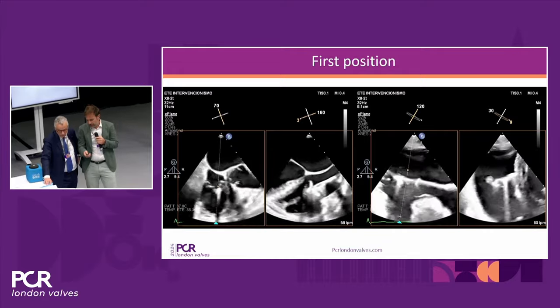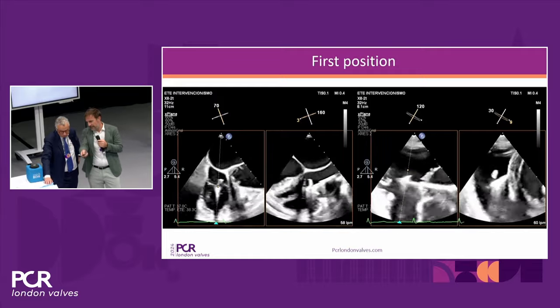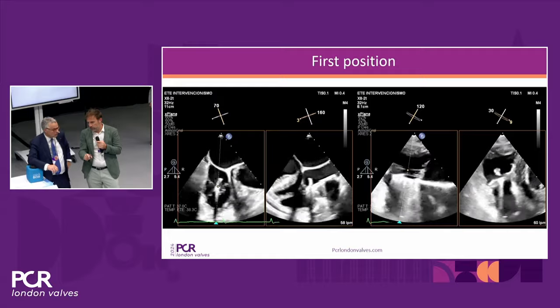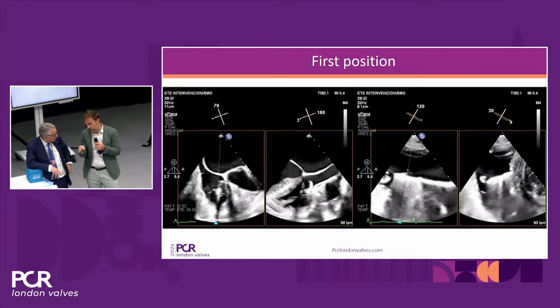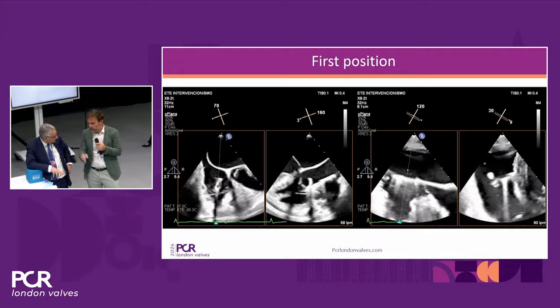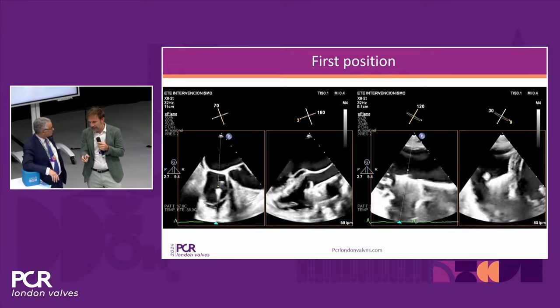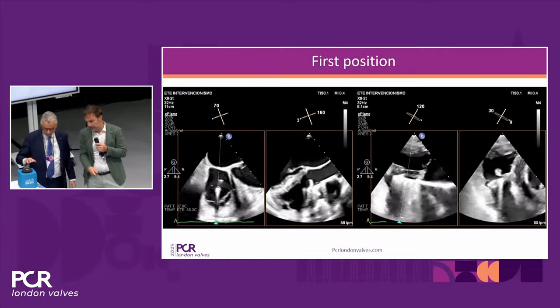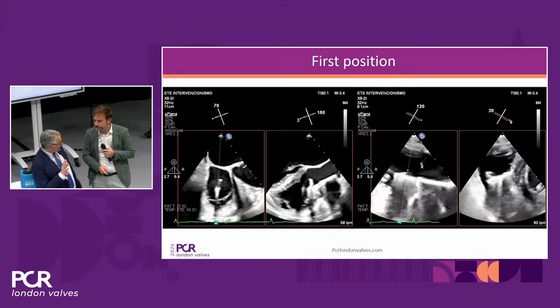As you already commented, Francesco, it's key to get a really coaxial position. To do that, in most cases, you have to play with the wheels. What normally happens is that you have a trajectory that comes from lateral towards septal. So with the lateral wheel, you give some lateral and you can get a straight position, pointing just in between the two leaflets, as you can see here. So coaxiality is a key element.